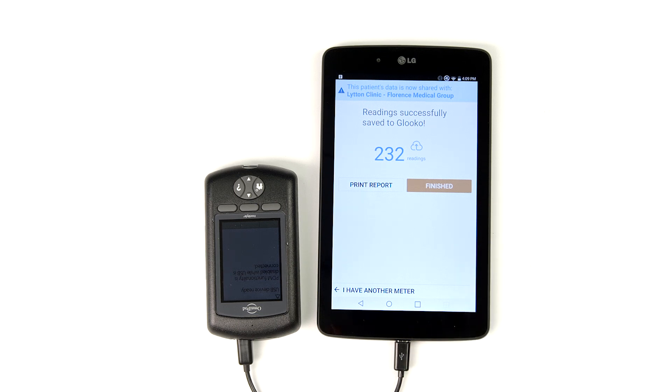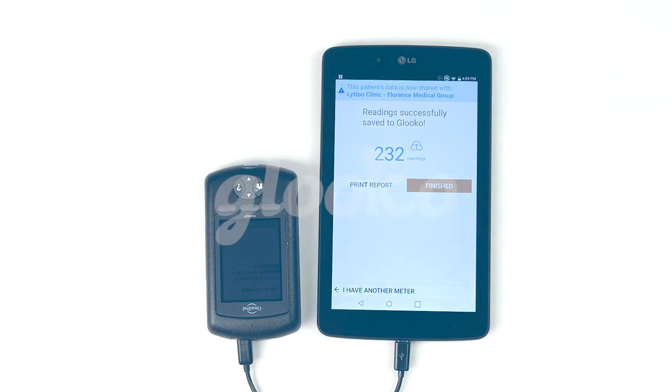Perfect! You've learned how to sync an Omnipod PDM with Glooko Kiosk and attach your patient's data to their Glooko profile. Happy syncing!